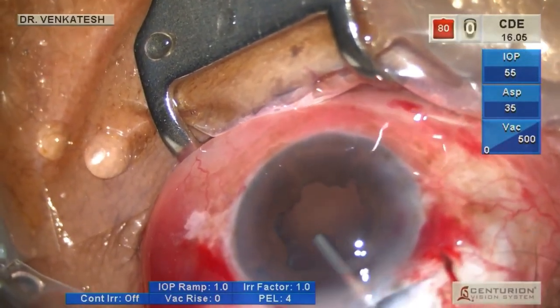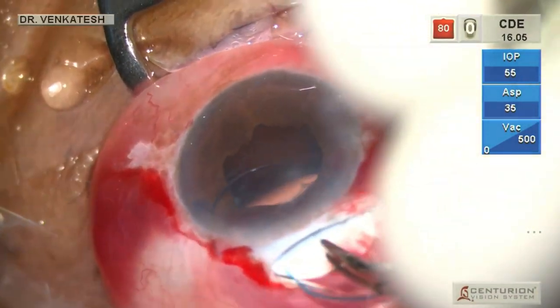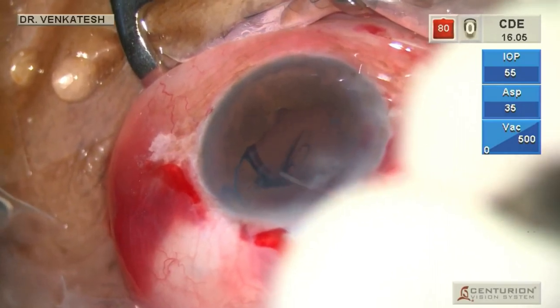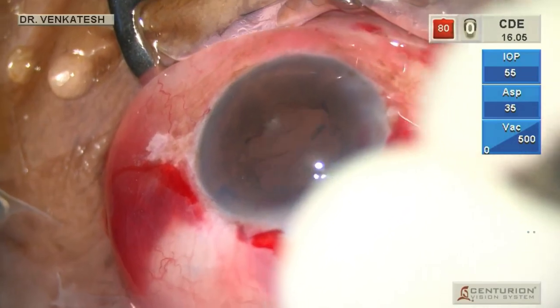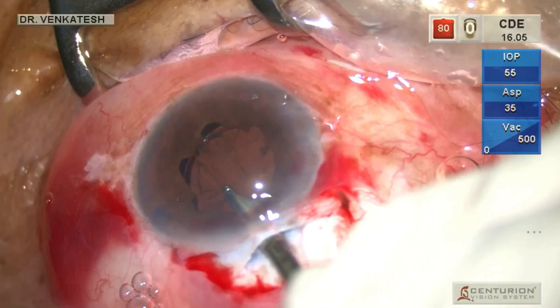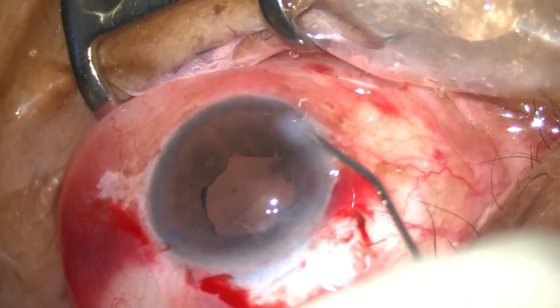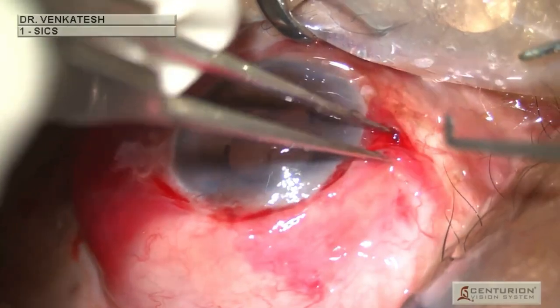The eye is filled with viscoelastic and a three-piece acrylic lens is gently dialed into the bag. The viscoelastic is then removed. The paracenteses are hydrated and the conjunctiva is cauterized.